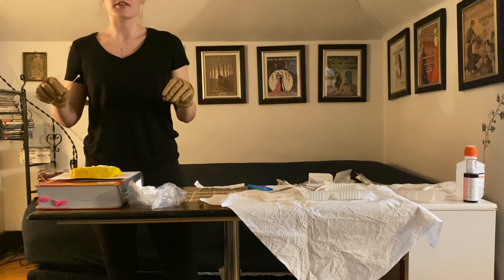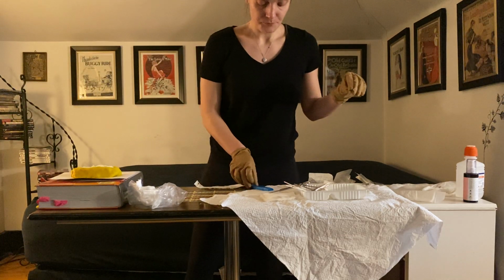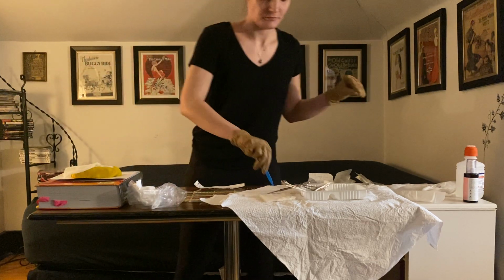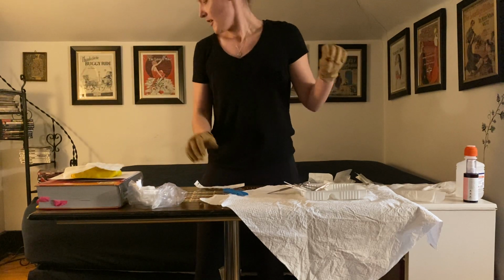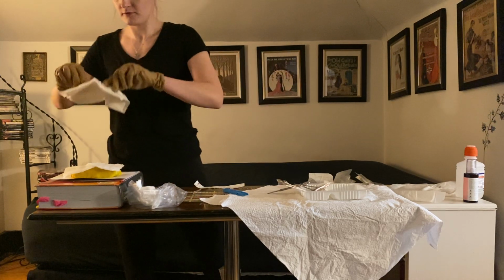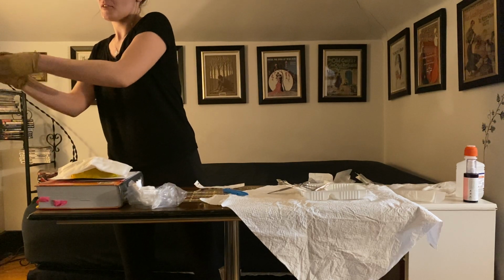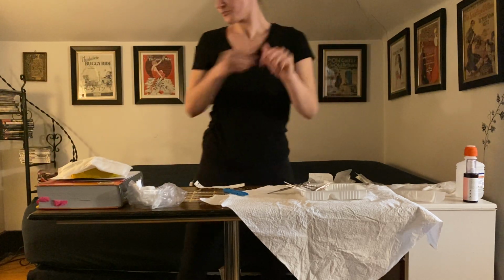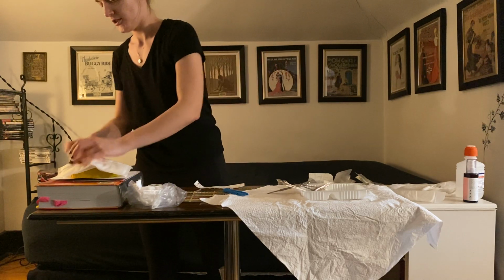And I'm going to show you the packing once I'm all finished at the end because it'll be a bit easier to work with my camera. But I'm going to dispose of that and then grab that. I'm no longer sterile, but I'm going to put my 2 4x4s on top. Putting that there. And then I'm going to put my abdominal pad. And then just because the tape's hard to work with gloves on, I'm going to take these off, perform hand hygiene, and I'm going to put the adhesive medical tape over at the corners.